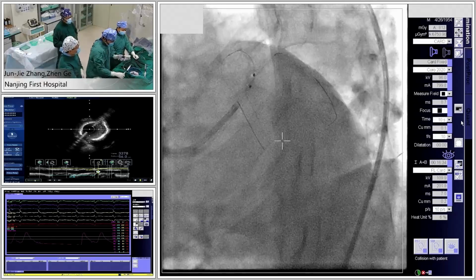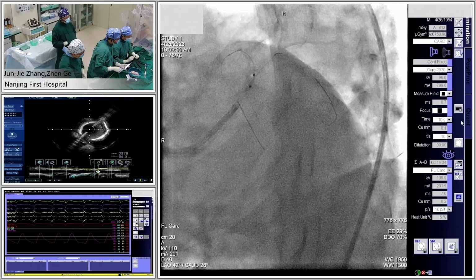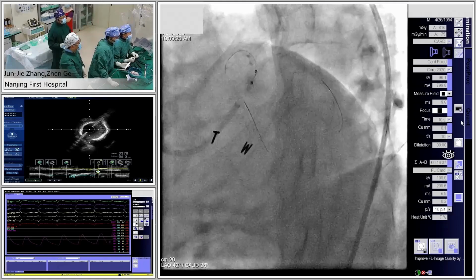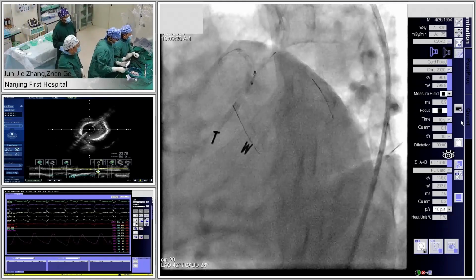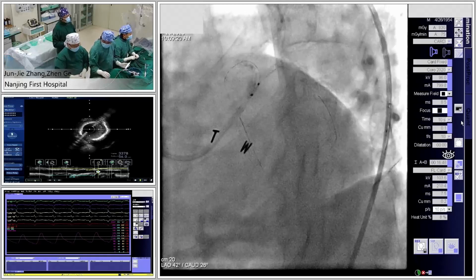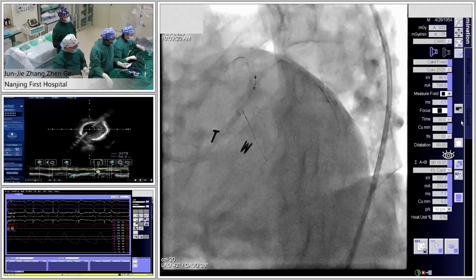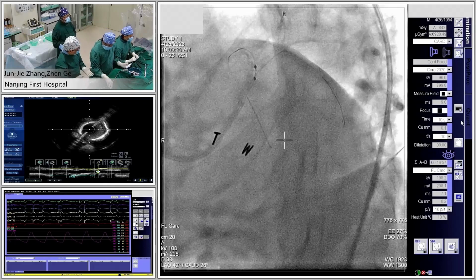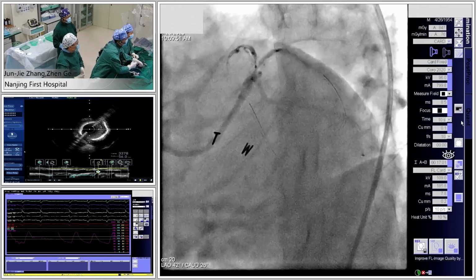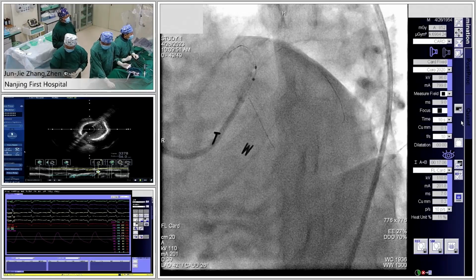Doctor, can you introduce the special teaching points for IVL therapy for these particular calcified lesions? We use T-wave. It's similar to the shockwave from other countries, but T-wave is a Chinese-made device. Choosing the size is important for this tool, and usually we use the IVUS measurement. Okay, we position the balloon just at the bifurcation site.